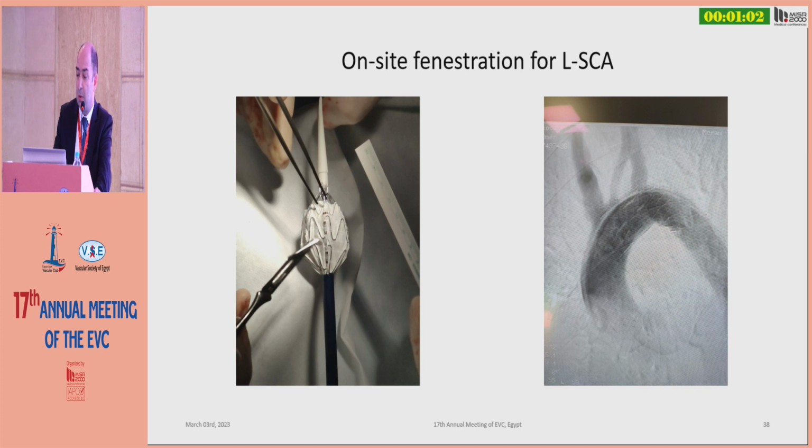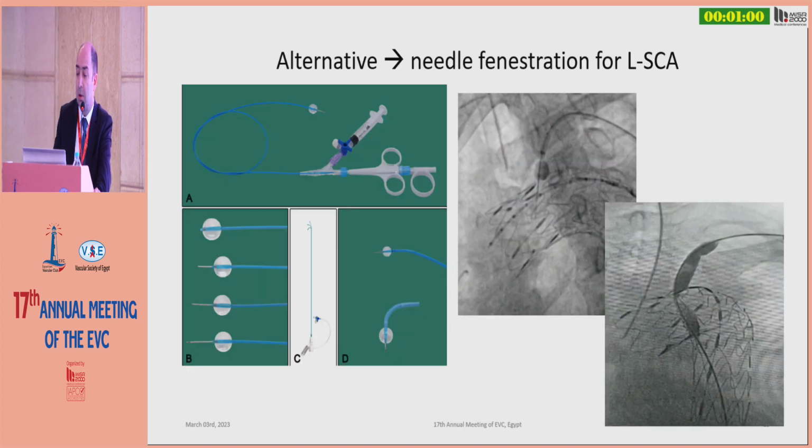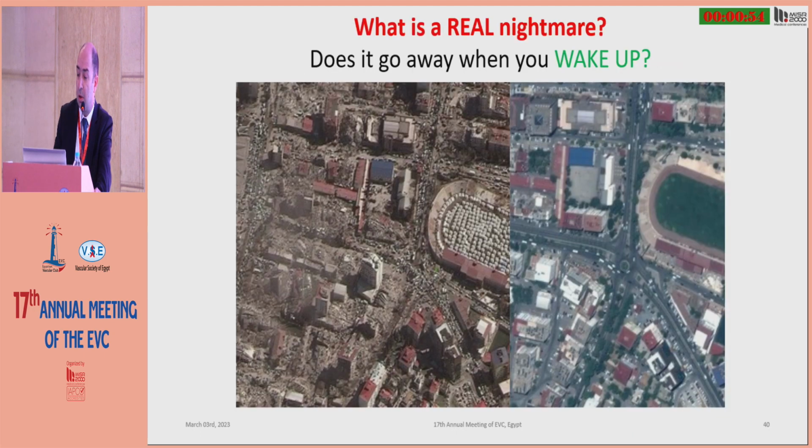We sometimes perform on-site fenestration, and alternatively, as we talked about yesterday, sometimes needle fenestration.